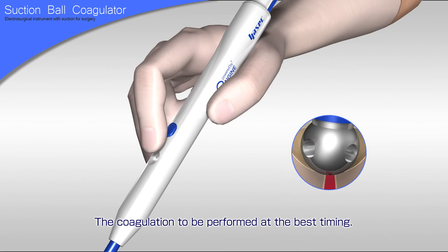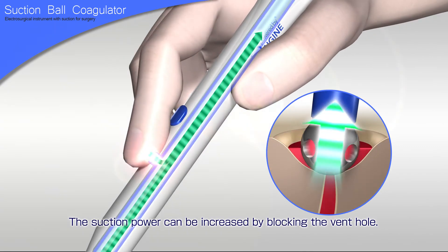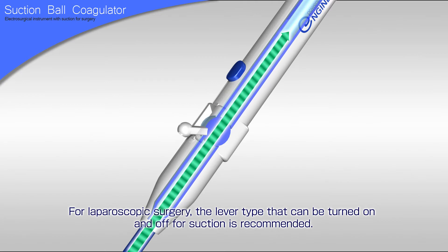The hand switch allows coagulation to be performed at the best timing. The suction power can be increased by blocking the vent hole. For laparoscopic surgery, the lever type that can be turned on and off for suction is recommended.